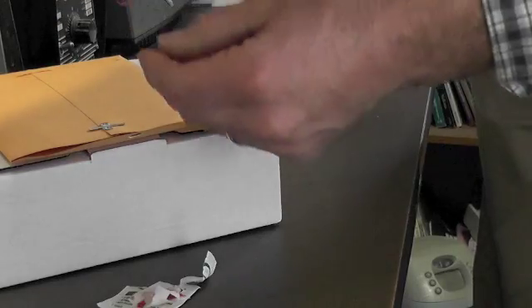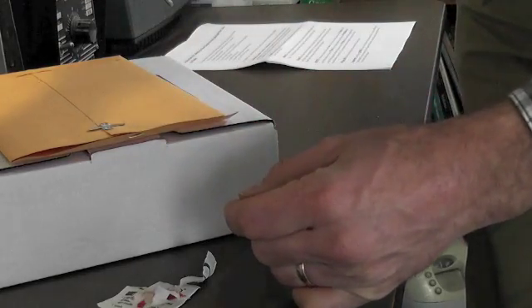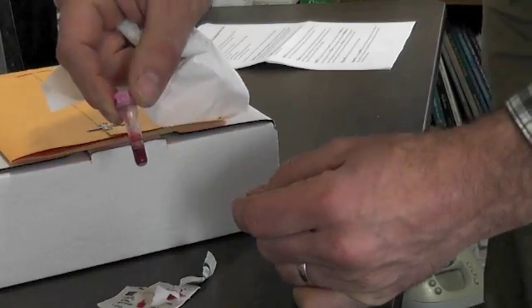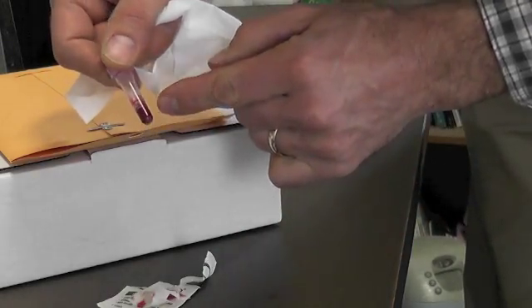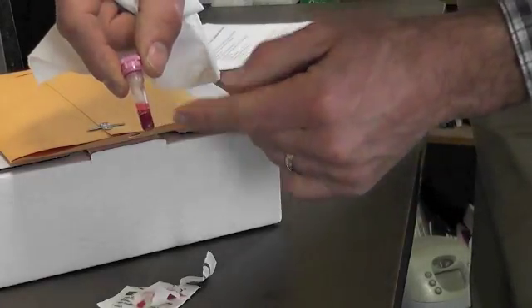There you go. So a little bubble in there. You can see there, that's a nice blood sample. They can work with that. It's just around 250, there's a bubble on the top. Yeah, it's a little over 250.